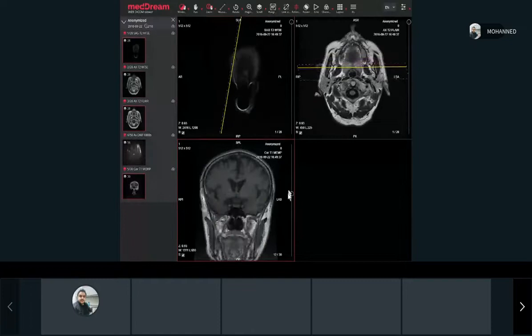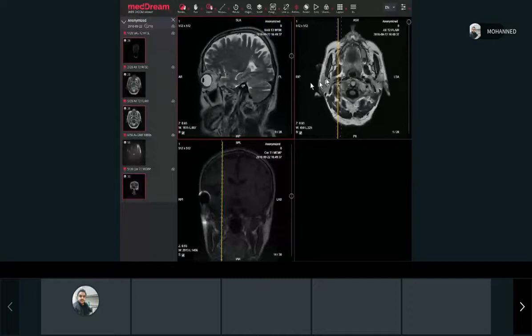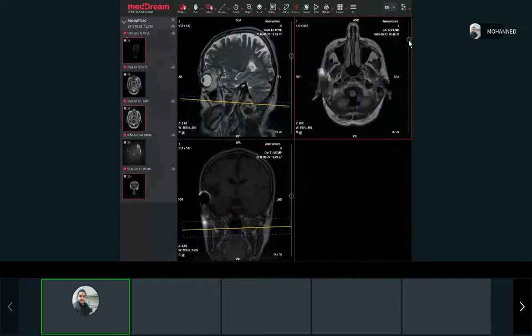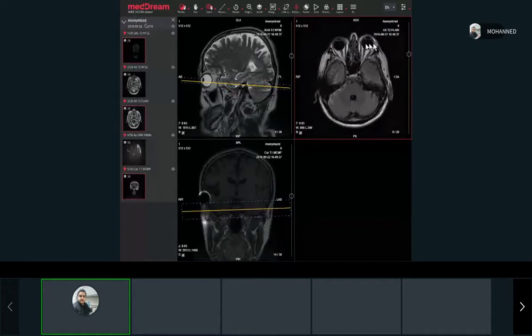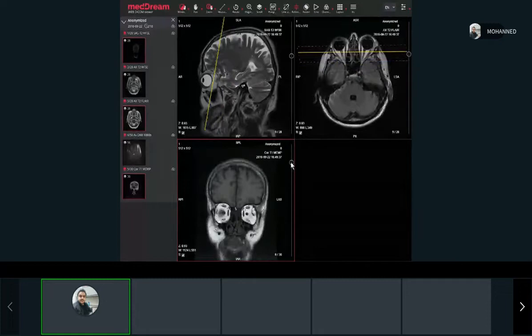See? And then you move here to be able to capture, for example, I want to see the eye because I cannot see the teeth here. They're not that clear, right? So now we're in the middle of the eye, correct? If I want to move a little bit more into it on this side, I can see the eye from the bottom or top. See, now I can see it. We can get it closer from the back to see the eye here. See, now we're looking at the eye from the inside.